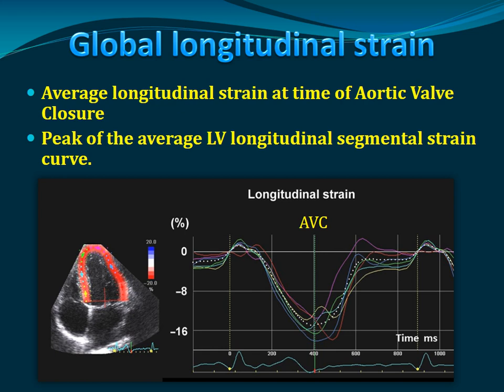Another thing that we can measure is, if we look at that, we can see that not all the peaks happen at the same time, so we can actually measure the peaks themselves, and then I'll go back to that because this is another way to look at what happens in oncology.